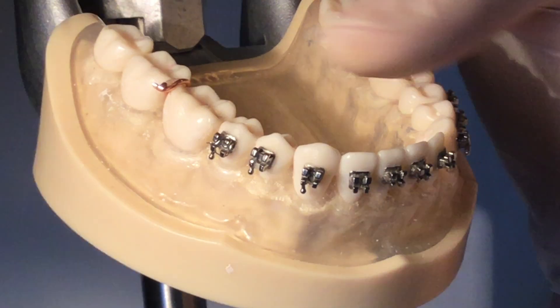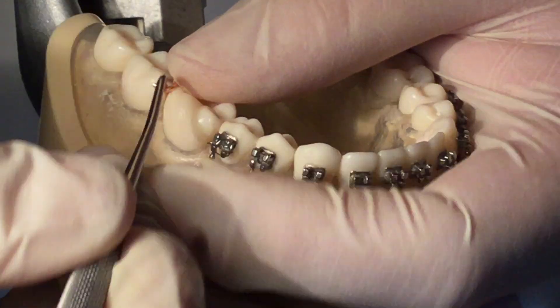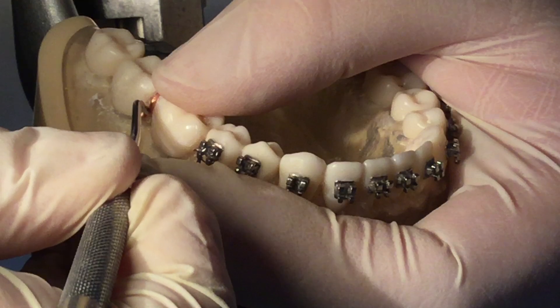Using the tucker, tuck the pigtail into the interproximal area.